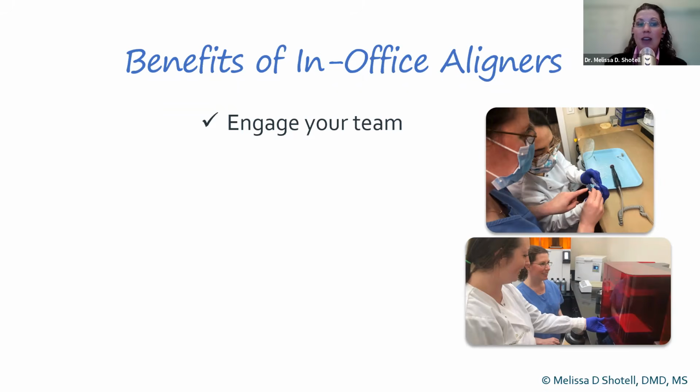We normally manufacture our clear aligners in small batches. However, I had team members come in and we completed entire cases for patients so that they would have time in the laboratory when we weren't able to see patients, but they were able to create their clear aligners for them, giving them some hours and time in the office so that they were able to stay engaged and stay working.